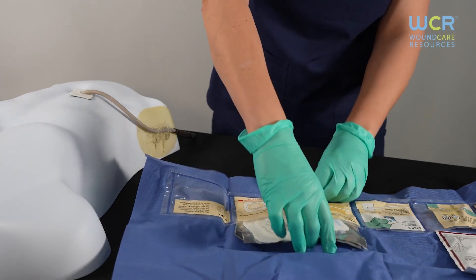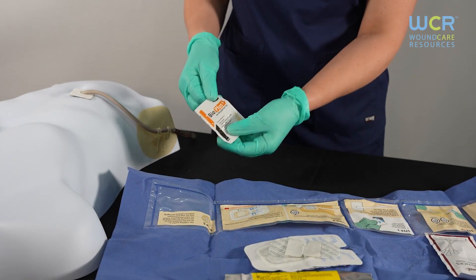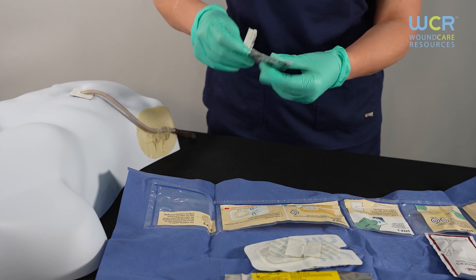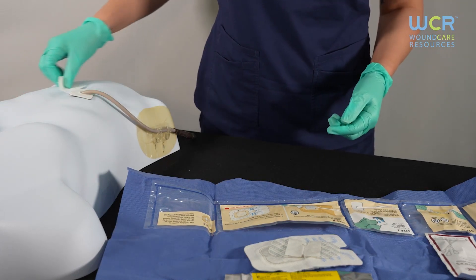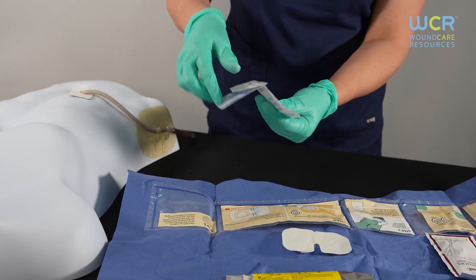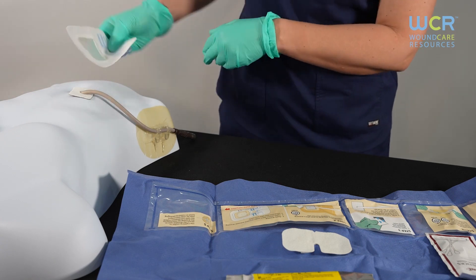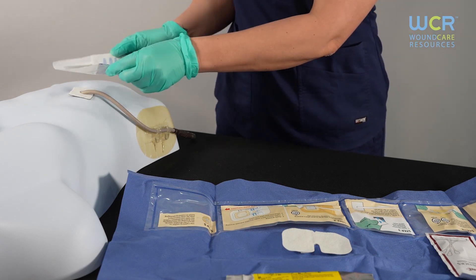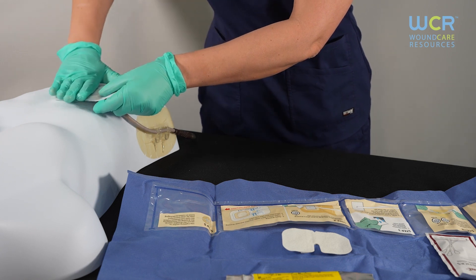Step 4 contains the BioPlus skin barrier. Apply the barrier to the area where the dressing will adhere, avoiding the driveline insertion site. Once the BioPlus is dry, apply the dressing by first removing the larger backing and lining the Silverlawn disc within the middle of the window. Remove the remainder of the backing and press the dressing into the patient's skin.